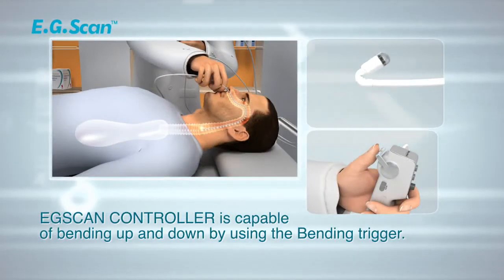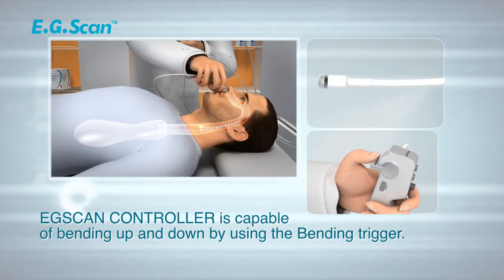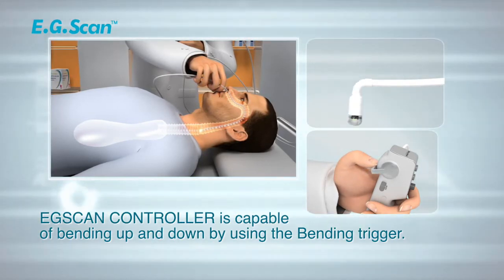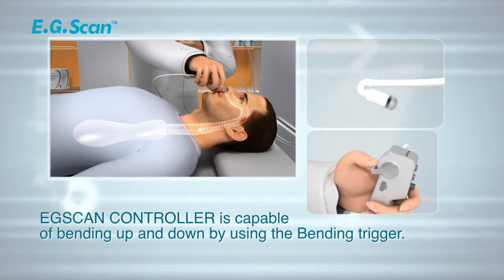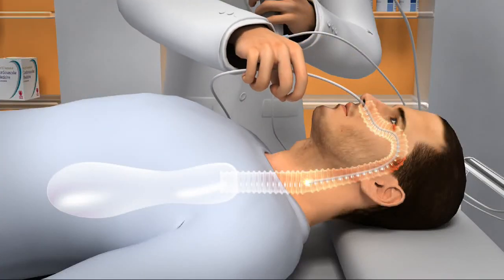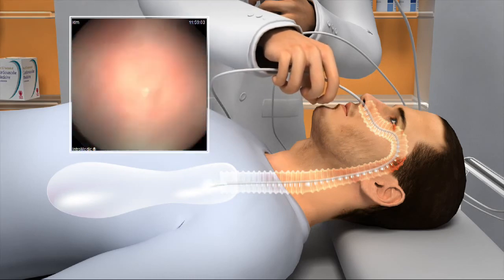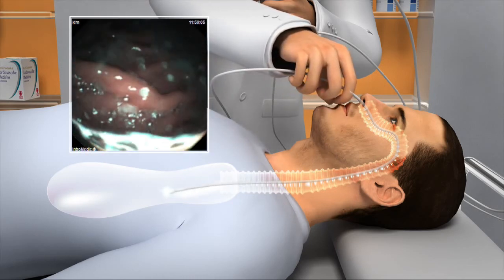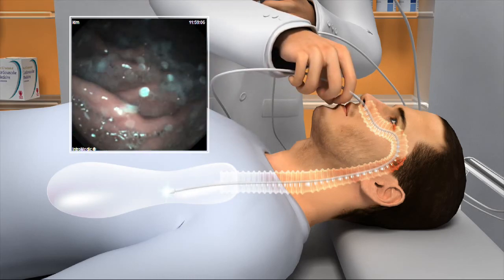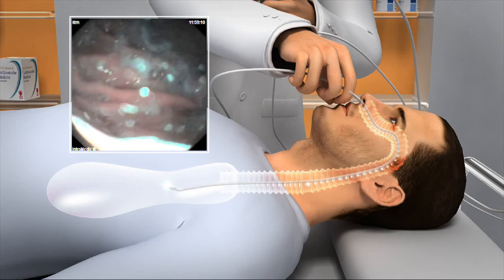The EG Scan controller is capable of bending up and down using the bending trigger. When the probe passes through the esophagus, let the patient swallow the saliva. Be careful not to let the end of the probe stray out of the esophagus, and insert the probe fully inside the esophagus.